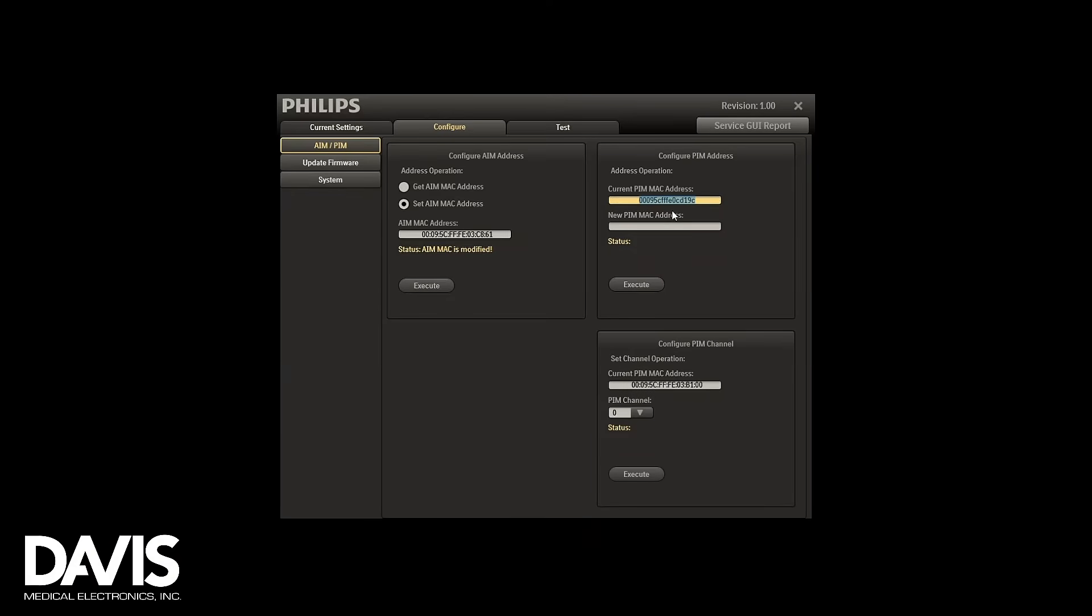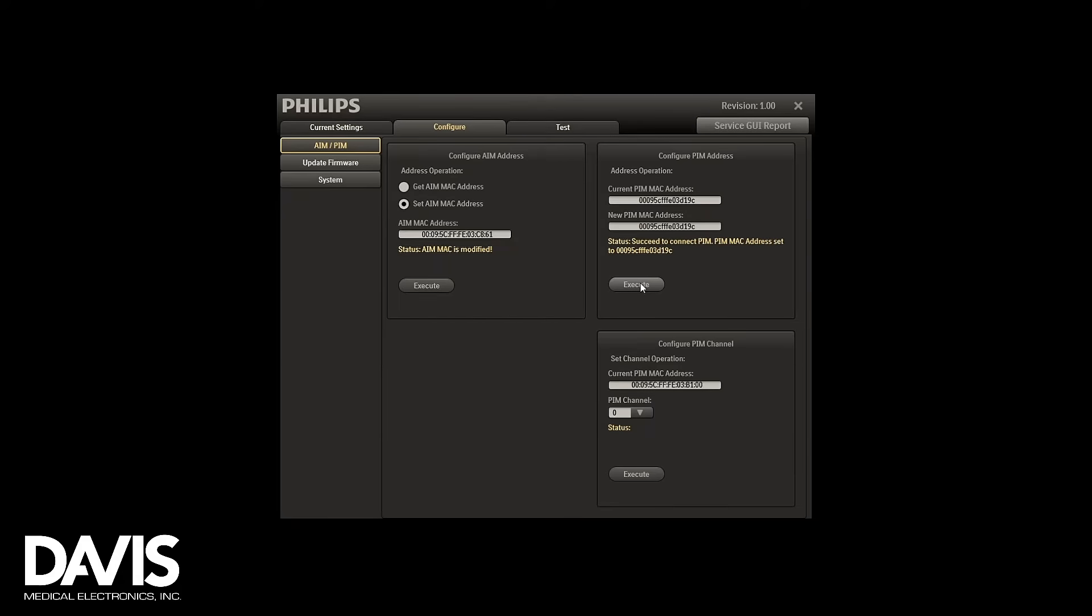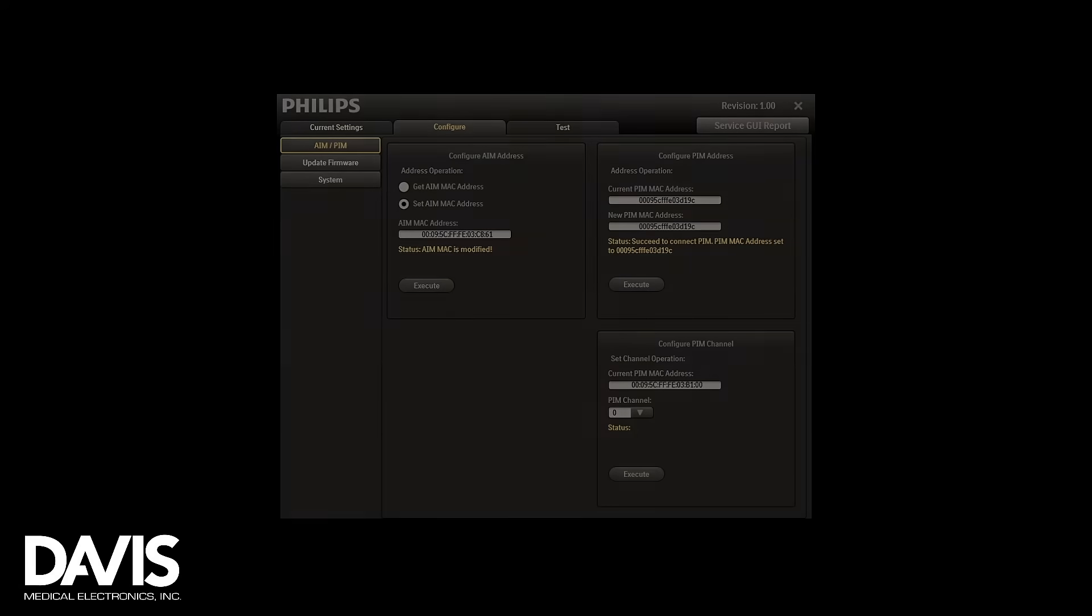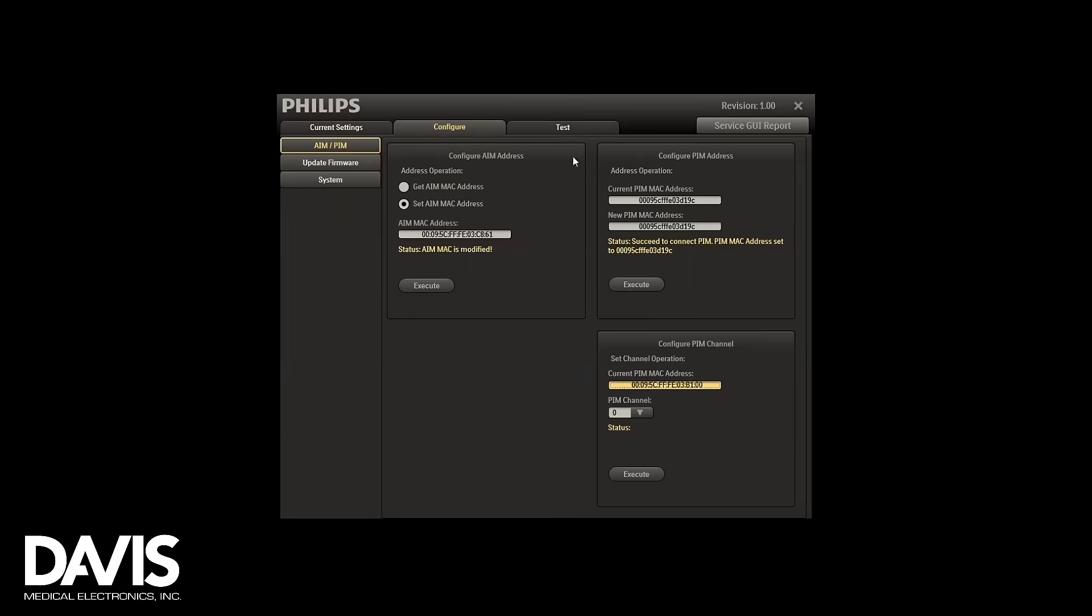Copy and paste the Mac address into the new PIM Mac address field and execute. You should get a succeed to connect message. You will also paste this PIM Mac address to this section.